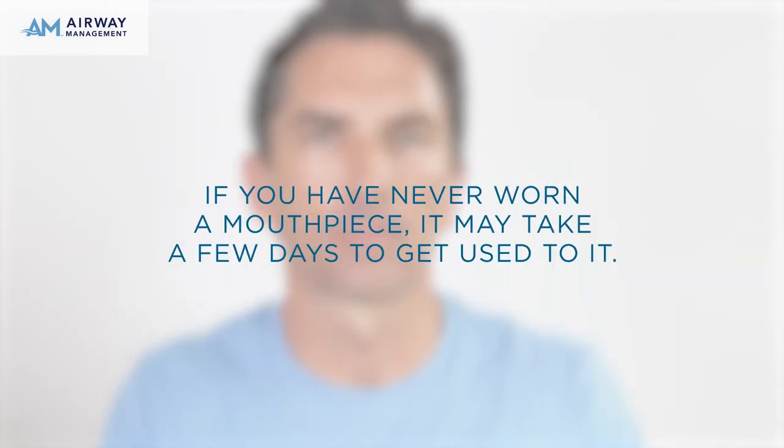Practice taking the mouthpiece on and off a few times. You should have a firm but comfortable fit. If you have never worn a mouthpiece, it may take a few days to get used to it.